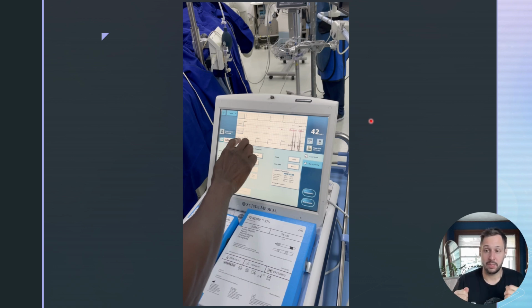Another thing to do when you look at impedance is you can go ahead and take the red off of the ring and hook it to the skin or a metal instrument in the skin. This effectively goes unipolar. If your unipolar impedance is higher than your bipolar impedance, it could indicate perforation, because if you think about it, you've now protruded through the tissue, which means you're kind of in air, right? It could also not be a perf. It's one of those little things in your toolkit to look for.